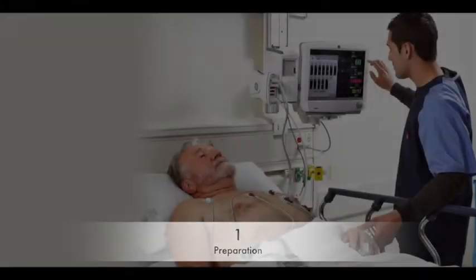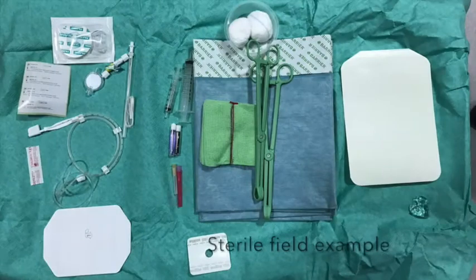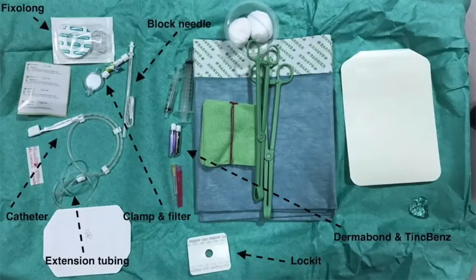The first step will be to consent and then prepare your patient with an intravenous cannula, standard non-invasive monitoring, in a suitable environment with a trained assistant. Your assistant can prepare a sterile field for you as shown here while you scrub up for the procedure.